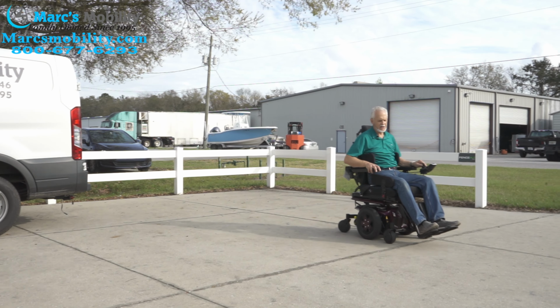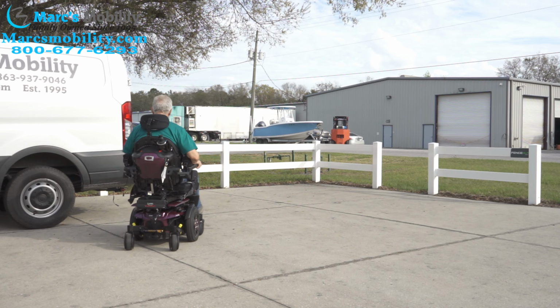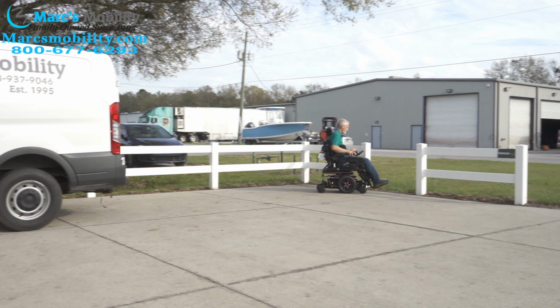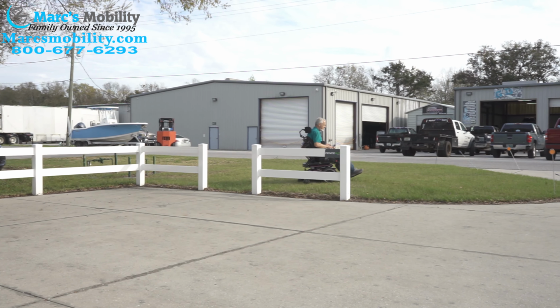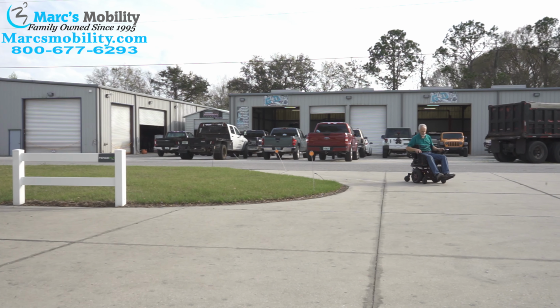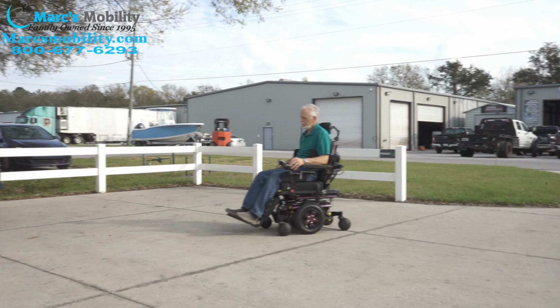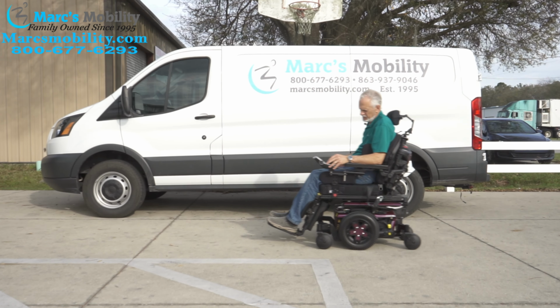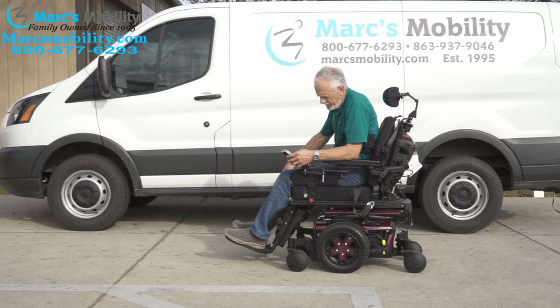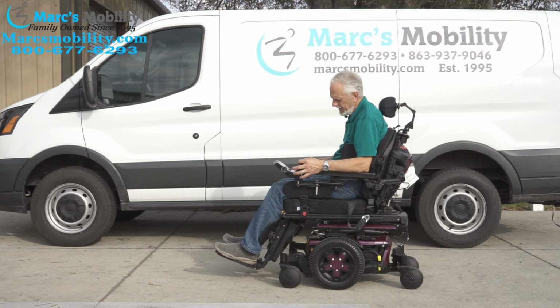The clicking noise you're hearing is me running over acorns. No problem to the grass. So what I'm going to do is I'm going to elevate the seat right now. Show you how it drives with the seat elevated.